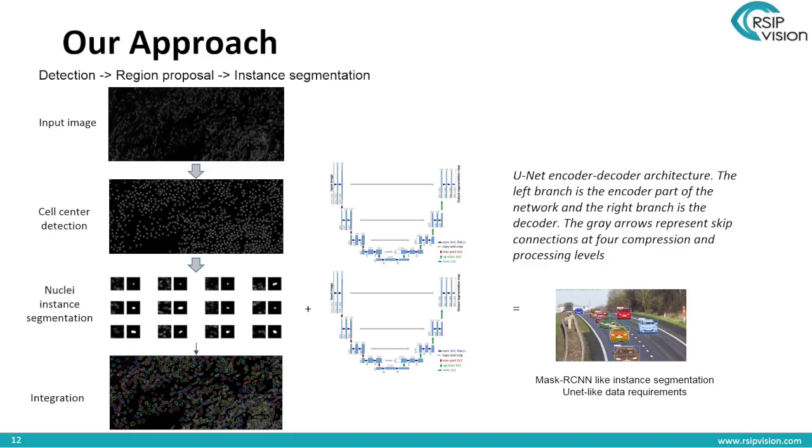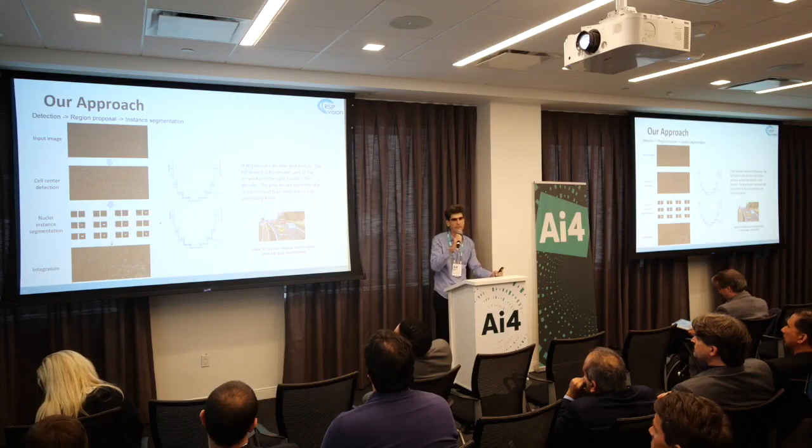And actually what we found to work best, and there are infinite ways of doing this, is to treat all the stages of this problem as a segmentation problem. I think this was mentioned in one of the questions in the earlier lectures, asking, did you try segmentation? So basically you can think of cell detection as a segmentation problem. It's not really segmentation. You're not trying to get a binary mask.